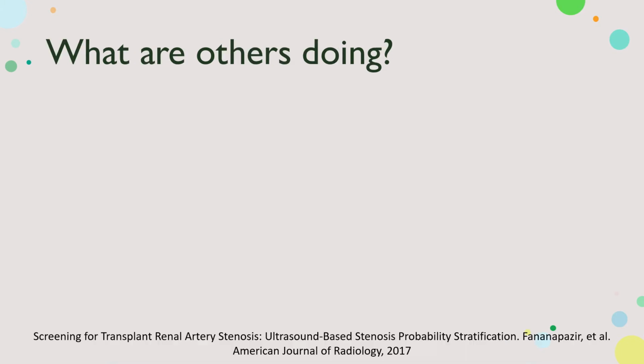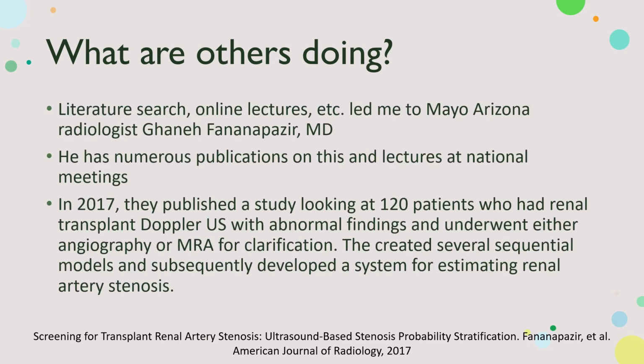So we demystified hydronephrosis. We've solved that problem. But the real problem comes with the Dopplers. What are we going to do about that? Well, when I did my literature search to see what was new, and I've got to be honest, I hadn't looked at literature since I was a trainee, so I'm a little behind the times.